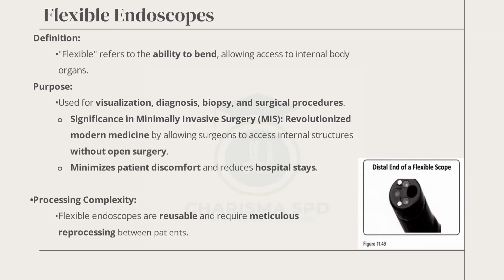And there's a big dot, that is a channel. They can pass a biopsy grasper there to grab a biopsy, manipulate some organs, or for therapeutic treatment.